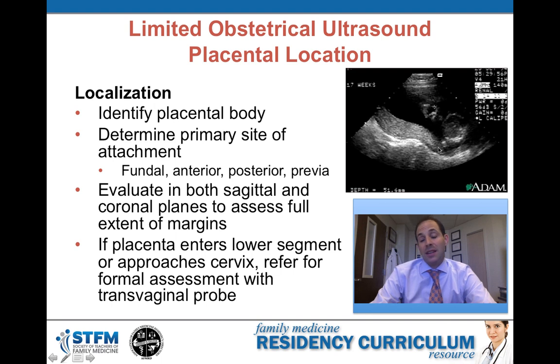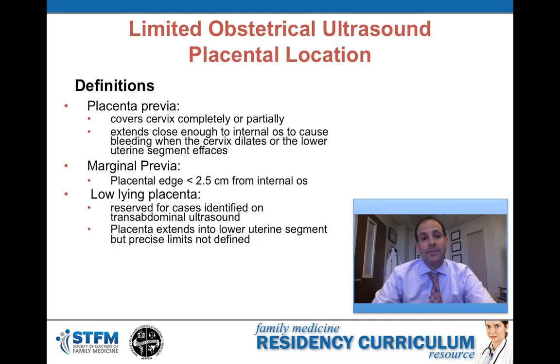But this is a still image, so while you're scanning in real time, you want to ensure that you're able to see the extent of the placenta in both planes. If the placenta extends into the lower uterine segment or approaches the cervix, that patient needs to be referred for a formal assessment with a transvaginal probe to confirm the presence or absence of a placenta previa.